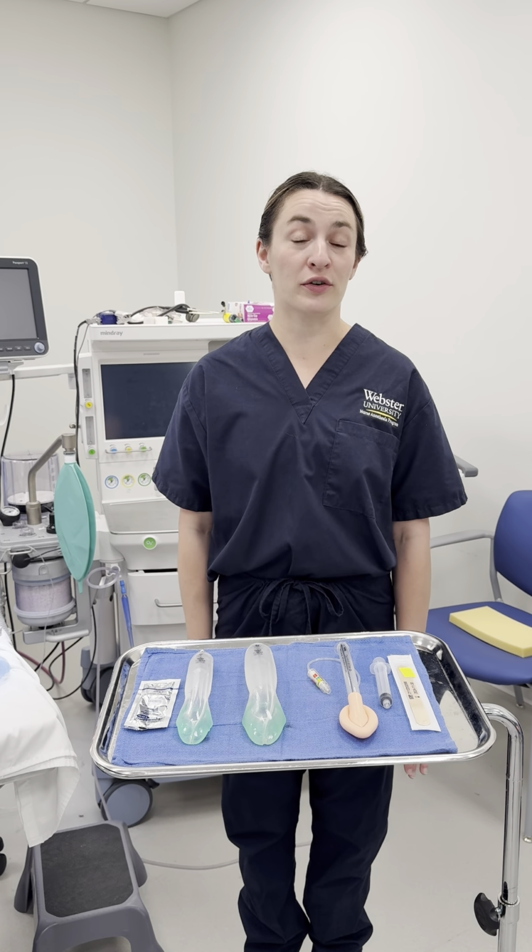So times when you should not be using a supraglottic airway would be patients that are at high aspiration risk, that have full stomachs or could aspirate during the surgery. With these devices, the patient could aspirate. The airway is not fully secured, so if that is the case, then go ahead and put them under general anesthesia with an endotracheal tube just to protect the airway, okay?